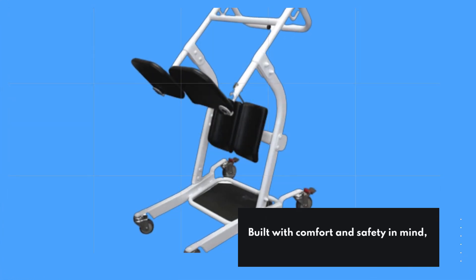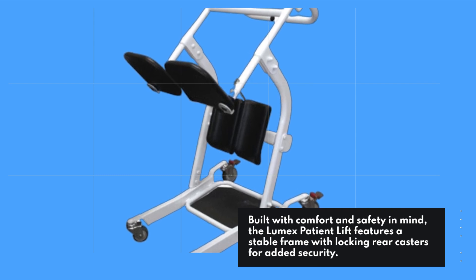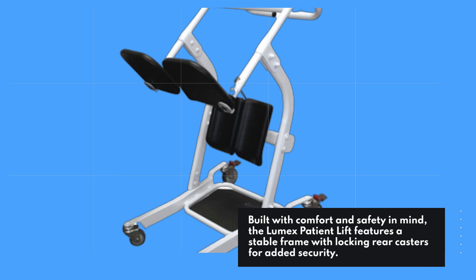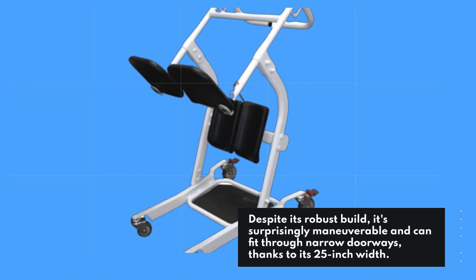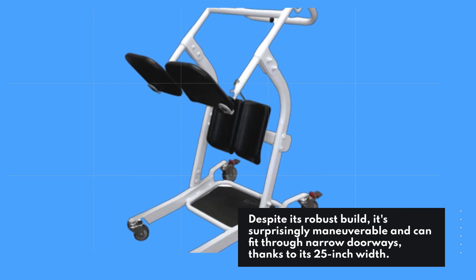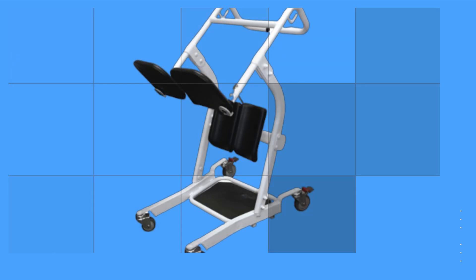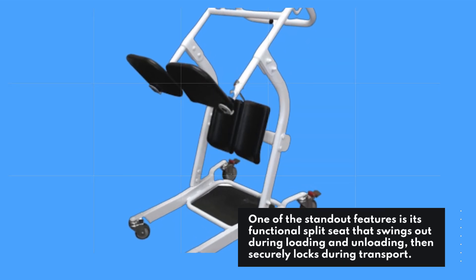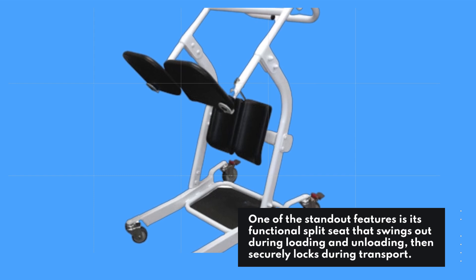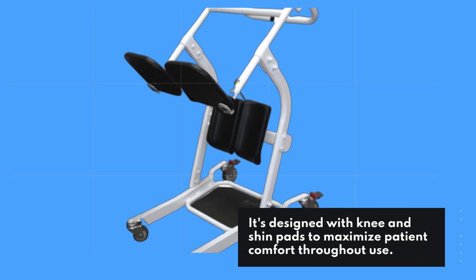Built with comfort and safety in mind, the Lumix Patient Lift features a stable frame with locking rear casters for added security. Despite its robust build, it's surprisingly maneuverable and can fit through narrow doorways, thanks to its 25-inch width. One of the standout features is its functional split seat that swings out during loading and unloading, then securely locks during transport. It's designed with knee and shin pads to maximize patient comfort throughout use.